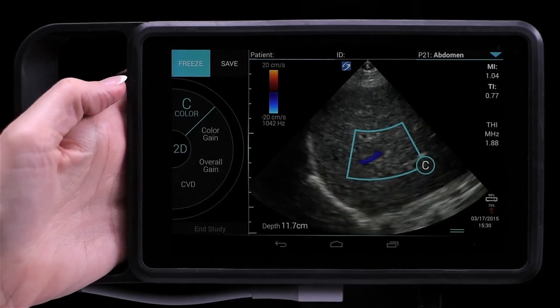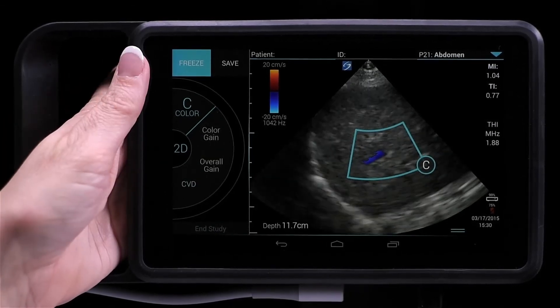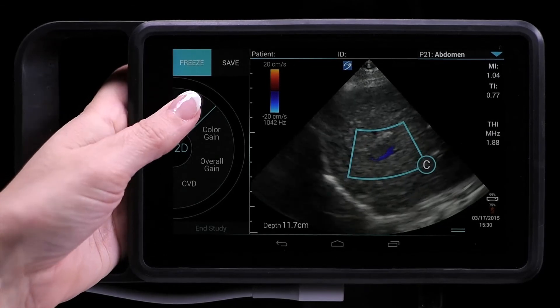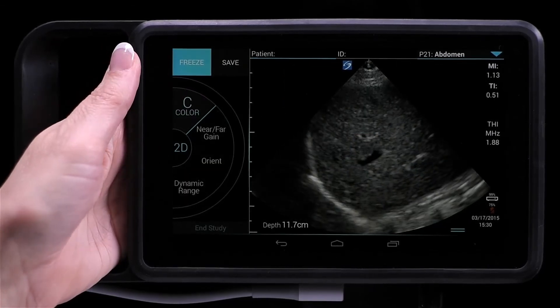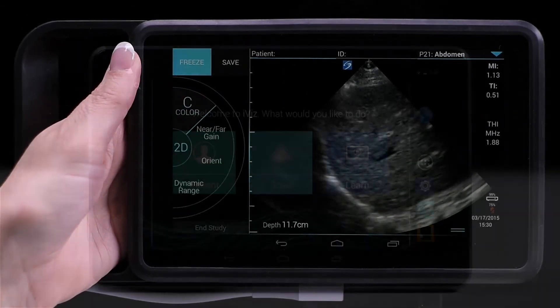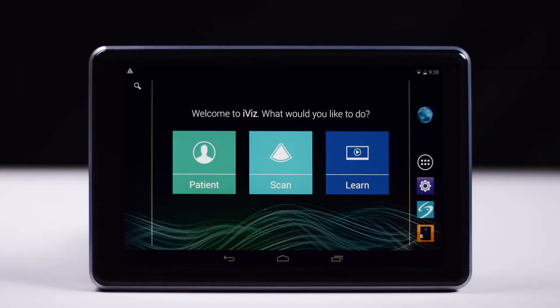Color Doppler toggles on and off. For more information about exams, refer to the iViz User Guide.